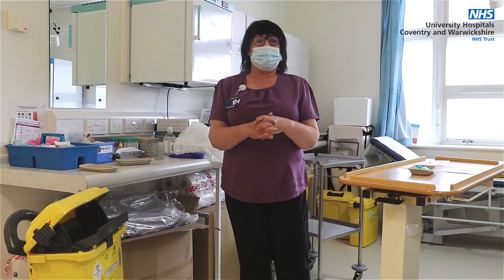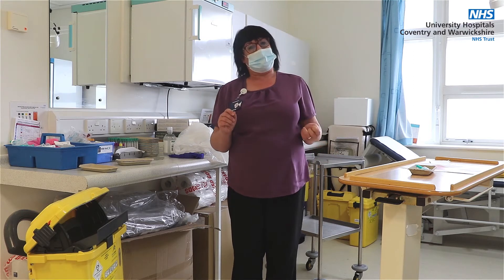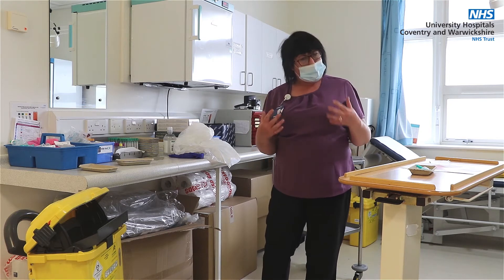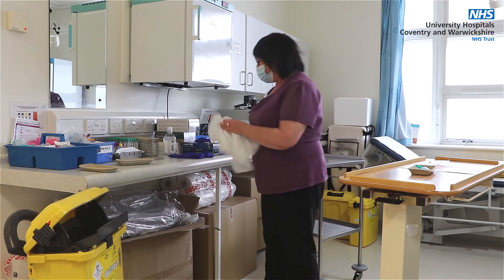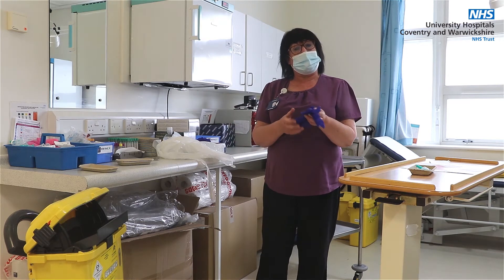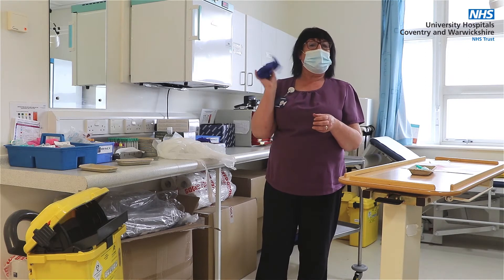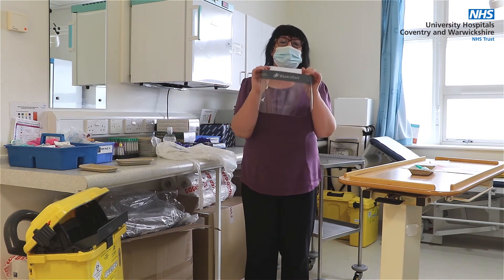Let's look at the kind of things that can prevent injuries for you. I'm going to say that I'm taking some blood from a patient, so I'm undertaking a phlebotomy procedure. Before I undertake the procedure, I'll take a minute just to think about what I need to protect myself. I'll need an apron in case there are any splashes, and because I'm having patient contact. I'll need gloves, as it's been proven that the risk to you from bloodborne virus can be reduced by 30% if you're wearing the correct PPE — in this instance, gloves. I'll also wear a visor in case there are any splashes to me.